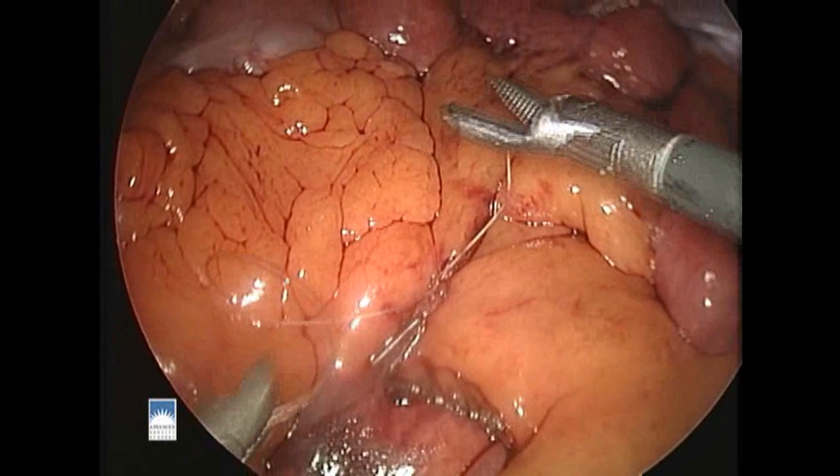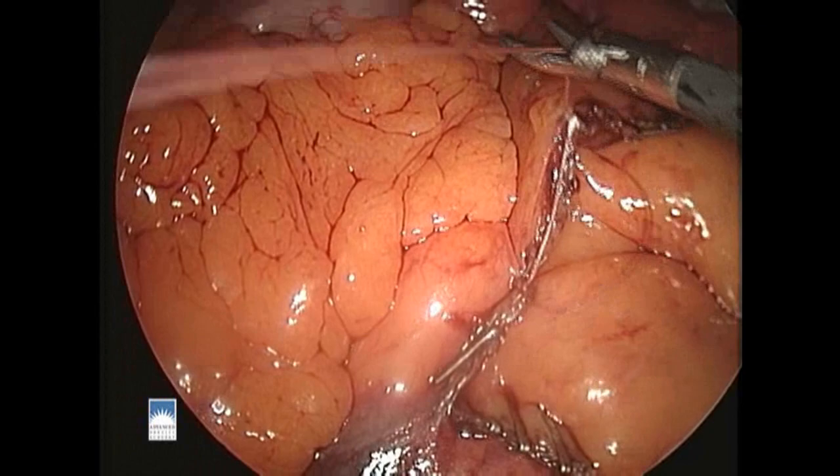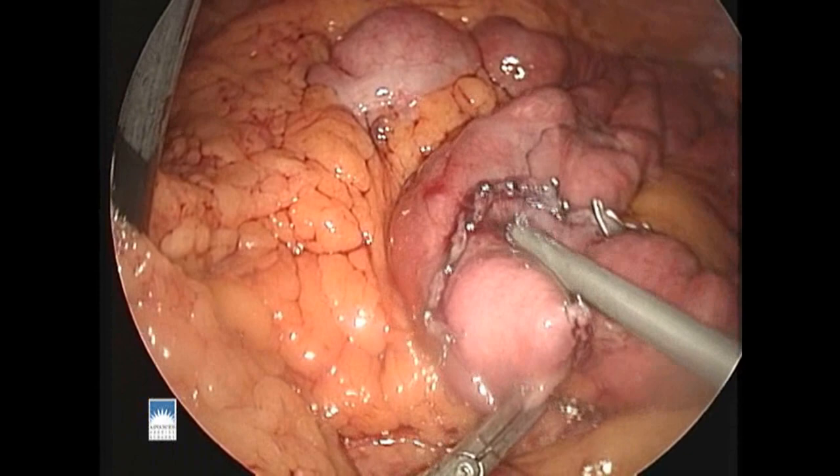Suturing the fatty drape closed in this way helps prevent internal hernias in the future. We then use a fibrin glue — like an epoxy made of chemicals that come from the blood — to seal up the areas of the staple lines.